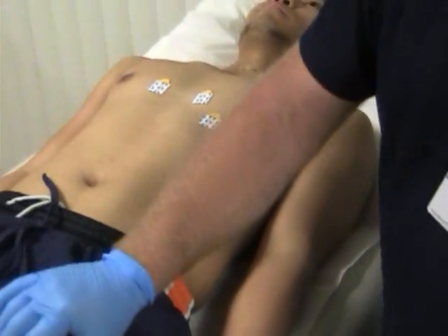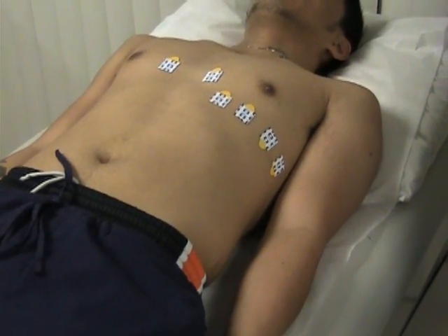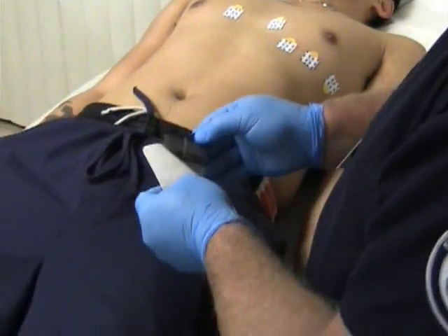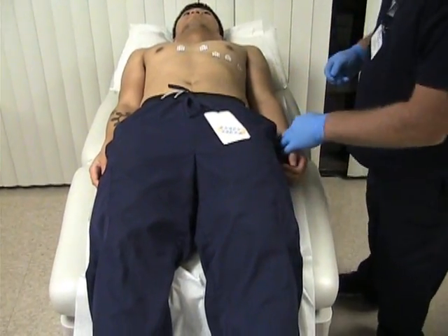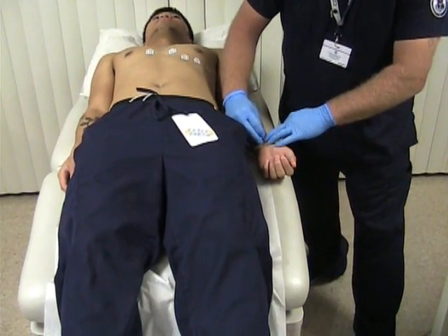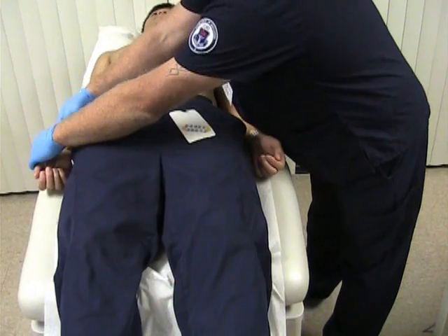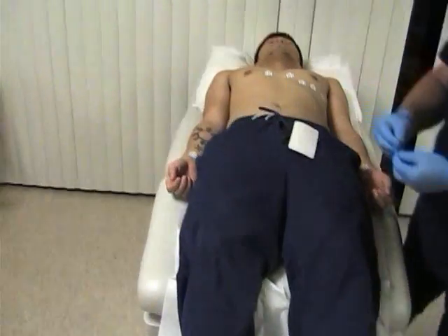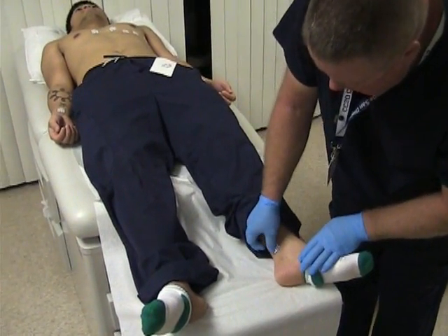Now we have our precordial leads in position. I'll now place the limb leads. The limb leads go anywhere on the left and right arm — not on any joints, not on any bones — just on the wrist or upper bicep. For the legs, we place them just above the ankle bone.